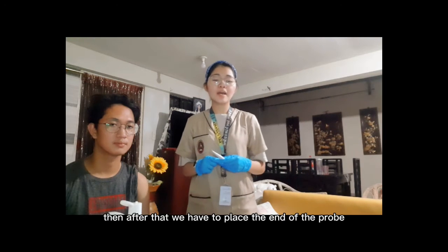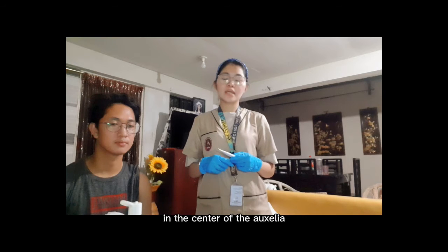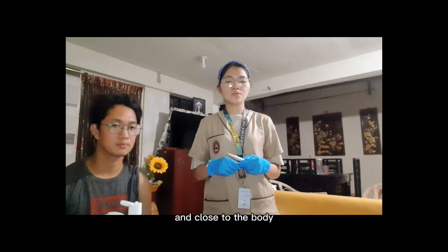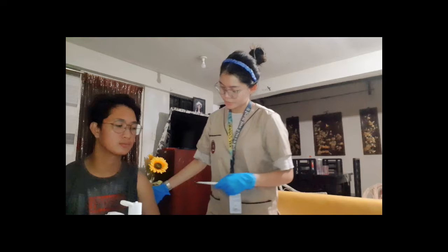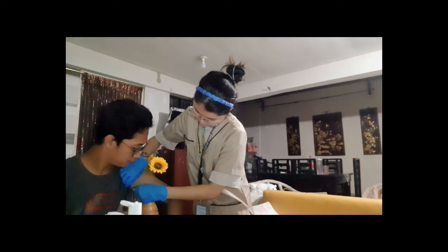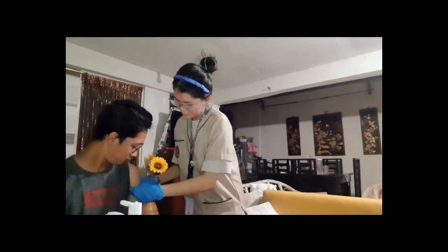Then after that, we have to place the end of the probe in the center of the axilla and have the patient bring the arm down and close to the body. So, sir, may I? Alright, very close.